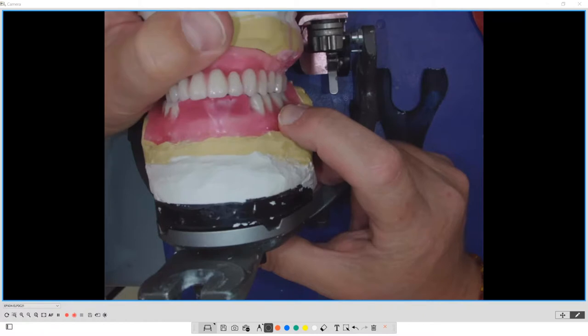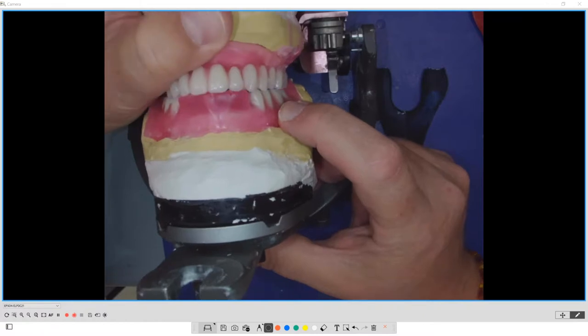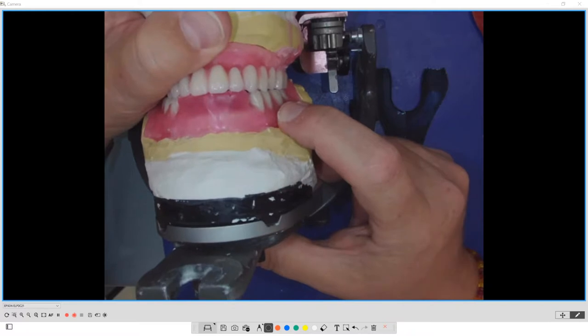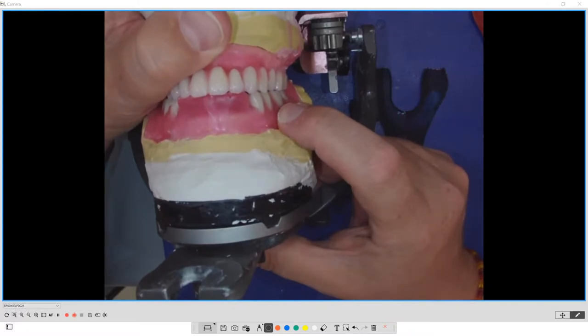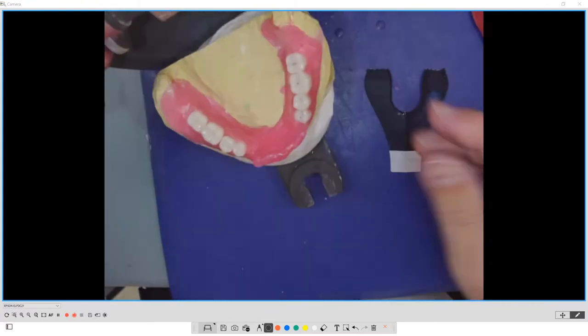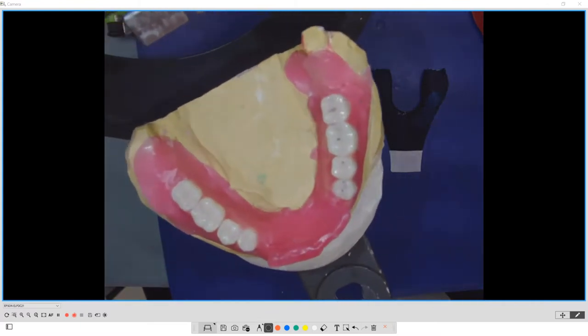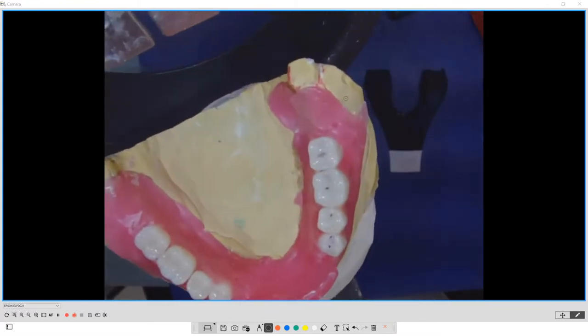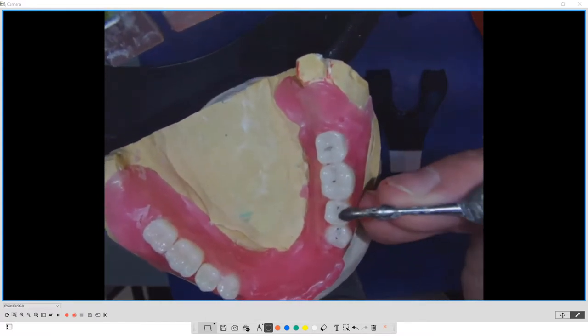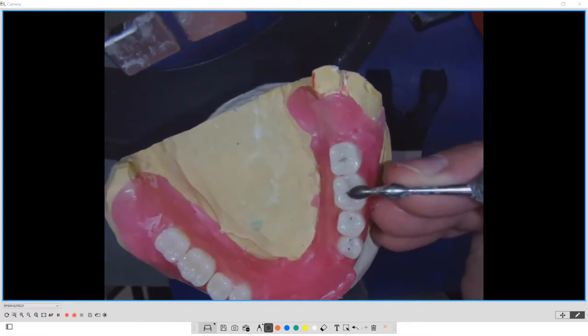English, second language if they have one. Why second language? Because when they leave your office, they're not speaking English. They're going to speak their second mother tongue. So that's their primary language. And now look what it did. Here, I'll bring it up. And you can see that the color bled down and it marks it for me.